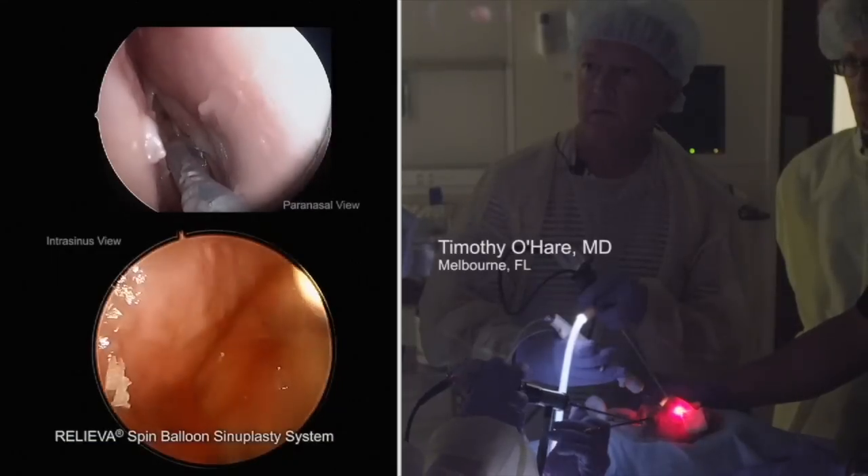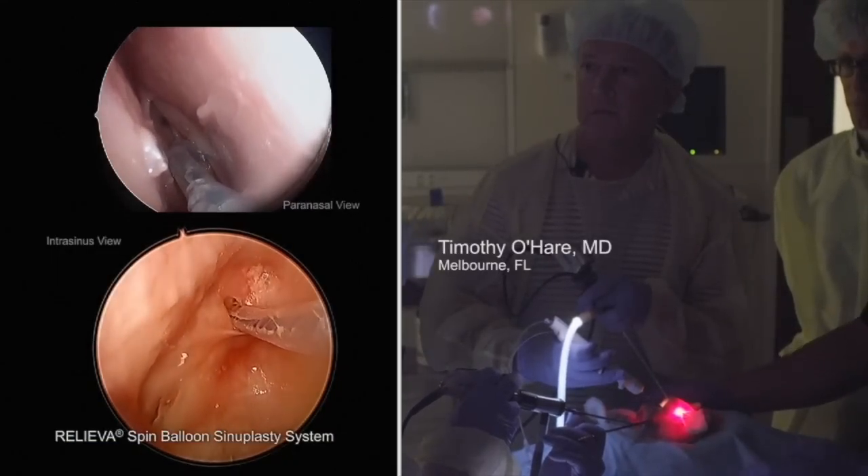Let's turn it back on — there we go. Okay, time out. Let's get that — see the pin point. Let's spin it for me. There's your pin point light. There it is — perfect.